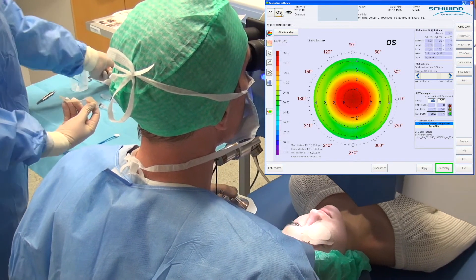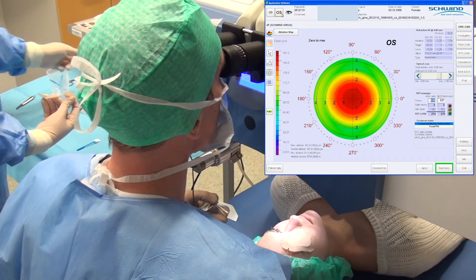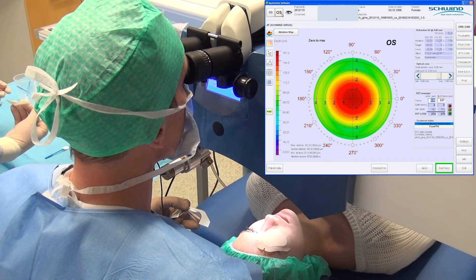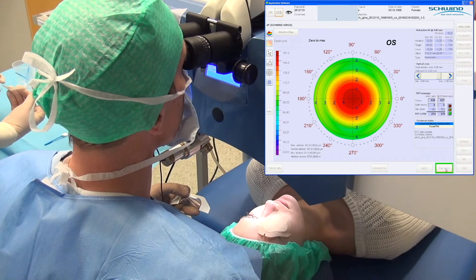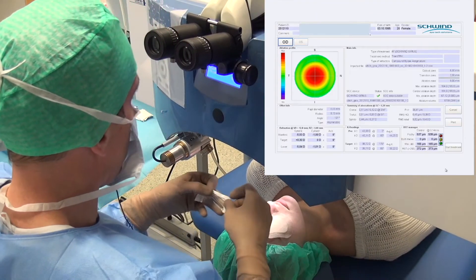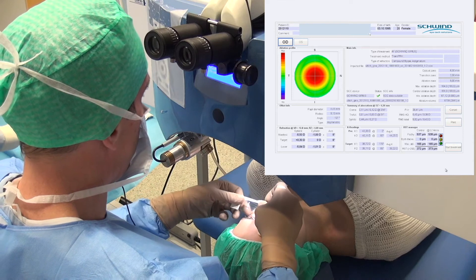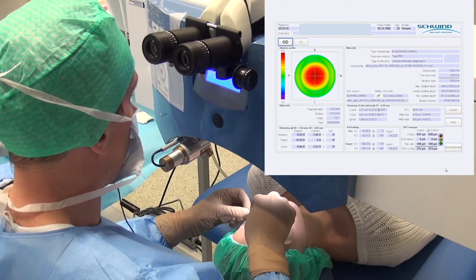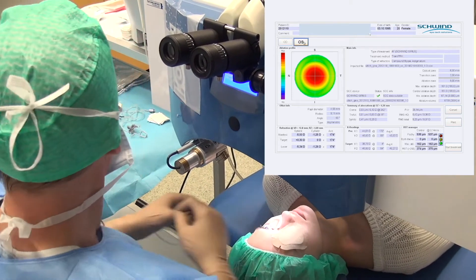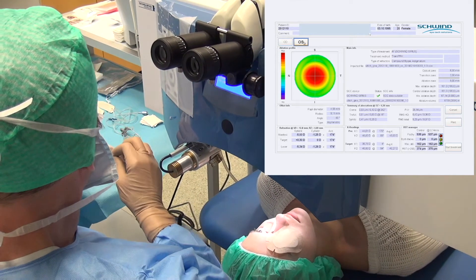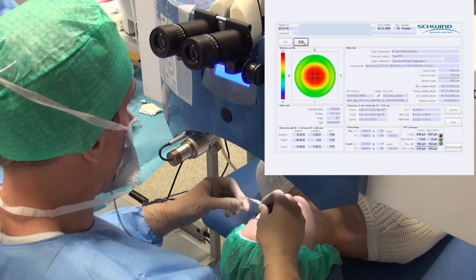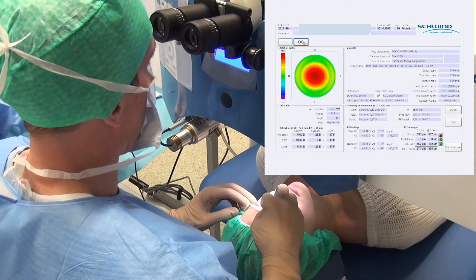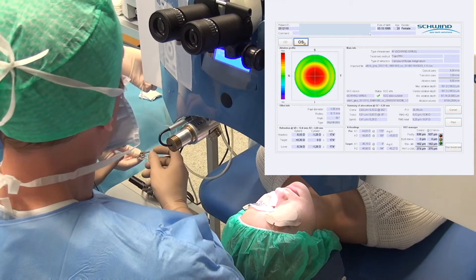Now the data of the left eye is the same. Here is the imported data that we sent to our laser system. In this case, we have planned an aberration-free ablation.